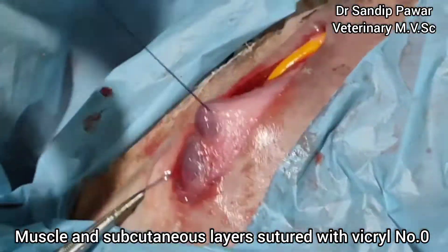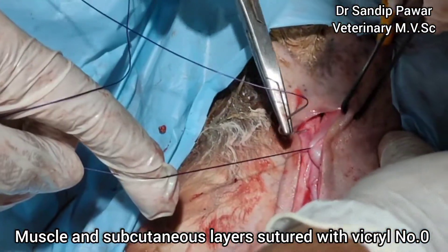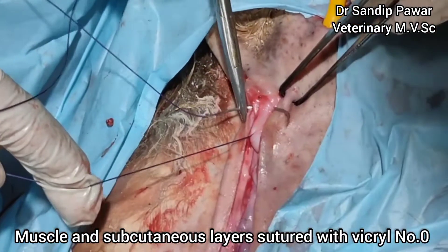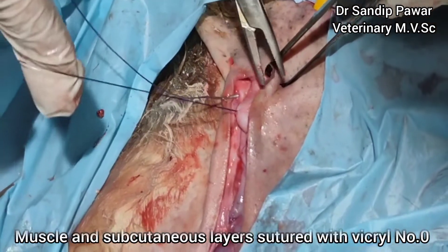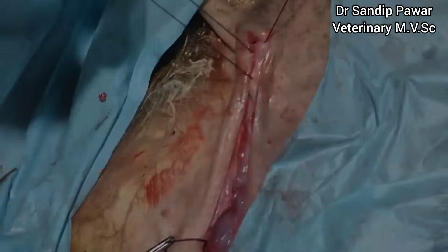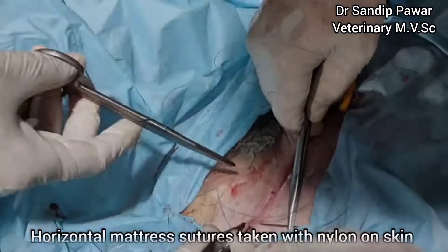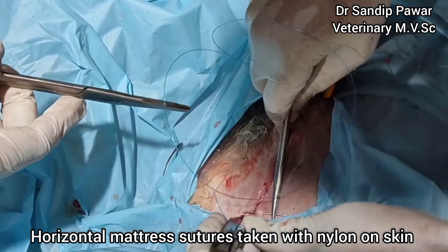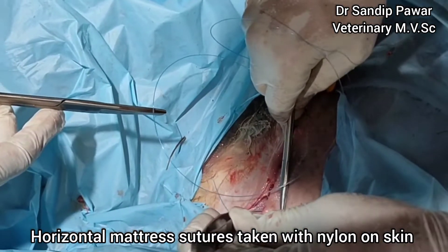And then, skin was sutured by horizontal mattress sutures using nylon as a suture material.